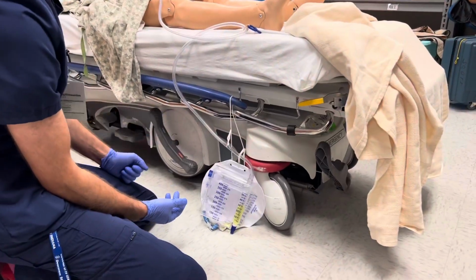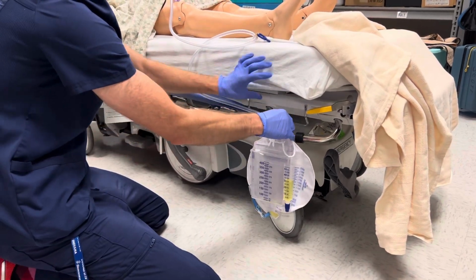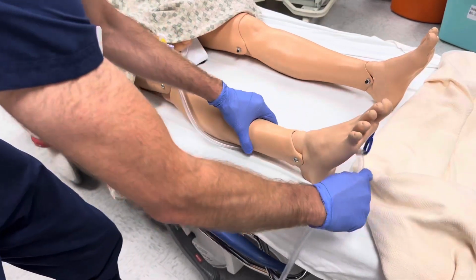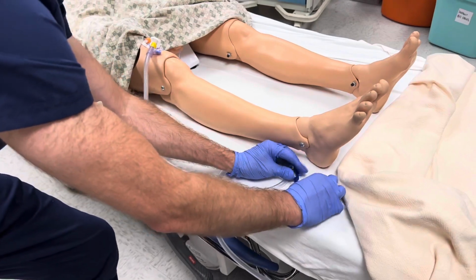On a similar note, the drainage bag should never be resting on the ground or hanging so low that it's touching the ground due to risk of contamination. Pinching or kinking can occur at any point in the drainage tubing, so just make sure the patient isn't laying on it or it's not wrapped around them.